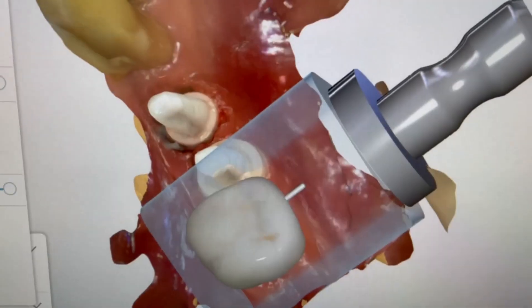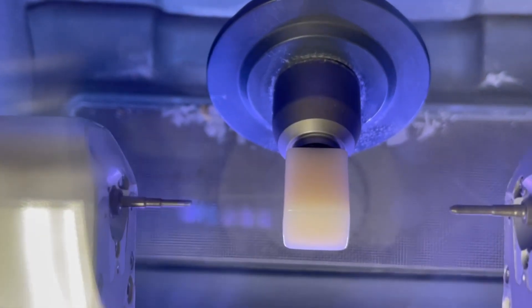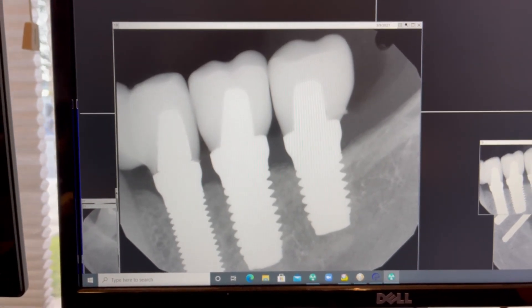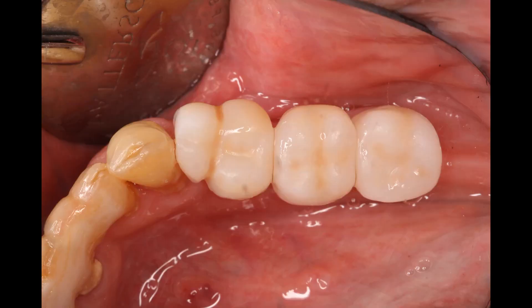Because the opposing dentition is really a full denture with acrylic teeth, we do not have to create these crowns out of a very rigid ceramic material. Instead, I use a ceramic polymer material called Lava Ultimate, which can be easily adjusted and repaired, and is a lot more forgiving on the implants than any rigid ceramic. The small cantilever you see was carved out of the first crown, which happened to be a little too far from the adjacent natural tooth — we just have to make sure to keep it out of occlusion to prevent eccentric forces and torquing on the implant crown.